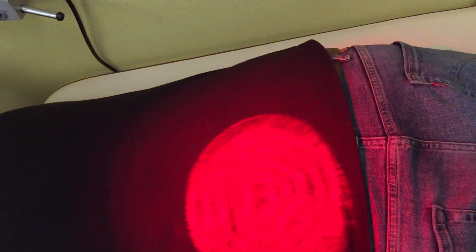This is the cherry on top of adjustment. You should be using this particular laser for every adjustment you use. It should take about 60 seconds to maybe 120 seconds maximum, and it is part of what we always finish our adjustments off with, so we get a higher degree of success.